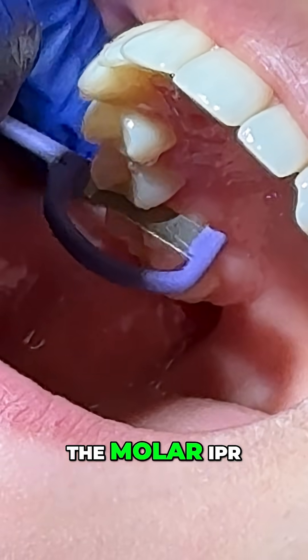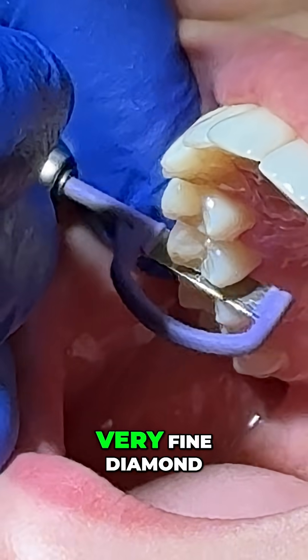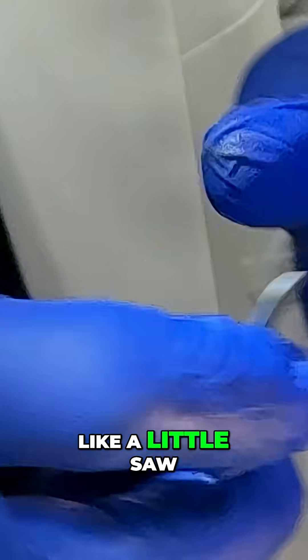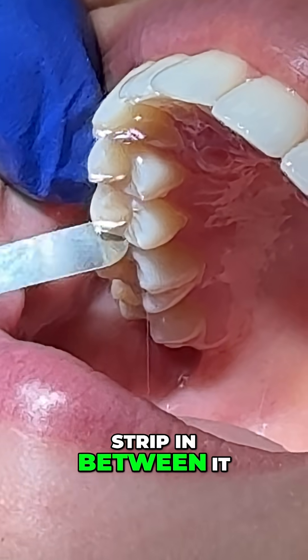So we start with the molar IPR. And doing the molar IPR, we can use a very fine diamond, or we can use this handpiece that looks like a little saw with an abrasive strip in between it.